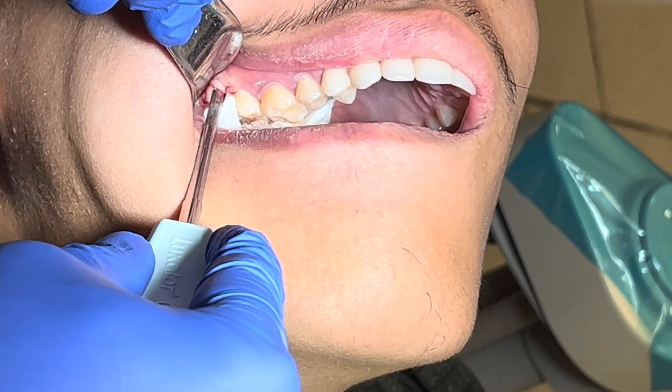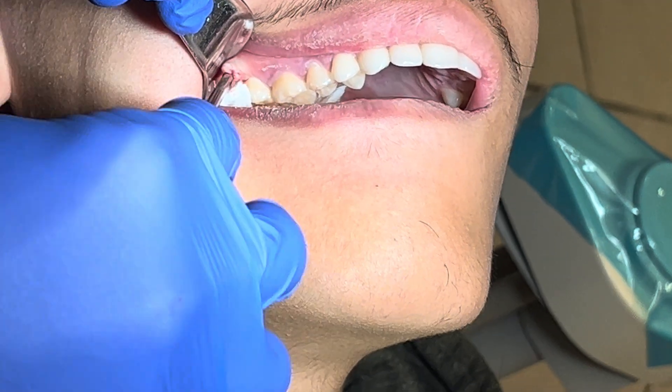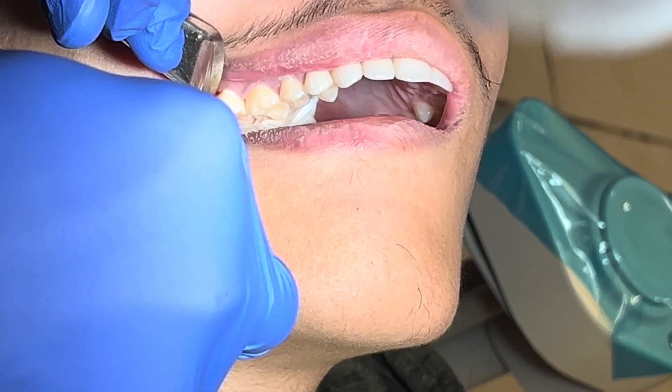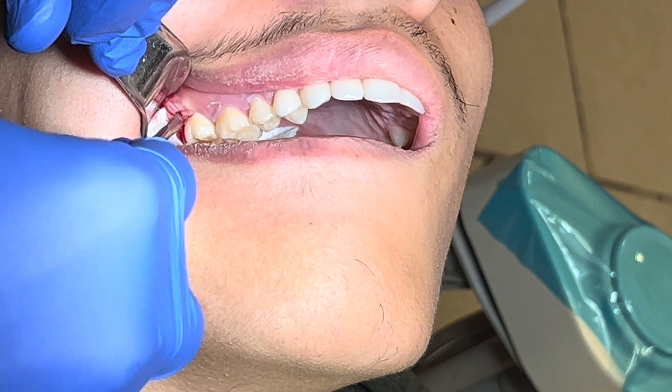Then you aim for the buccal surface, just aim to the alveolar part and luxate the tooth. The tooth gets really loose. You can hear a little sound — that's just part of the friction between the enamel and the elevator.